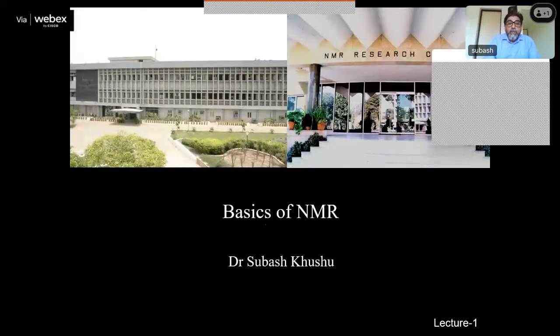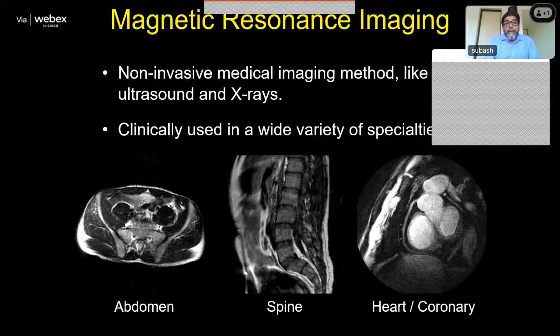So going to the topic, magnetic resonance imaging or NMR imaging is like any other imaging technique which you all know, whether it's computer tomography or sonography. It is another technique which is non-invasive, and it can be used in a variety of specialities in medical science.